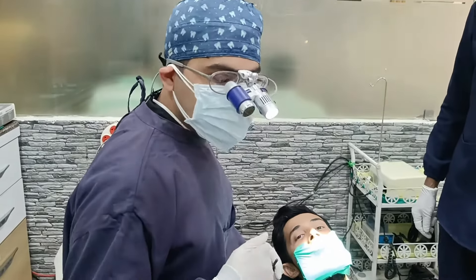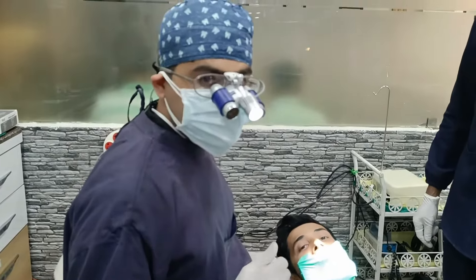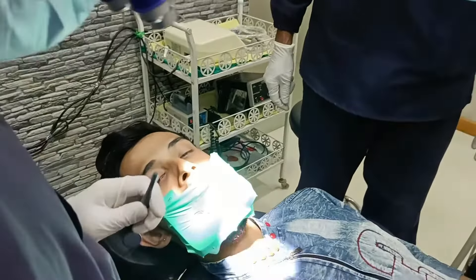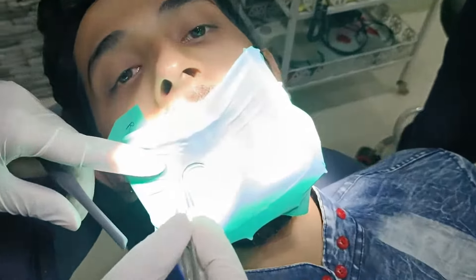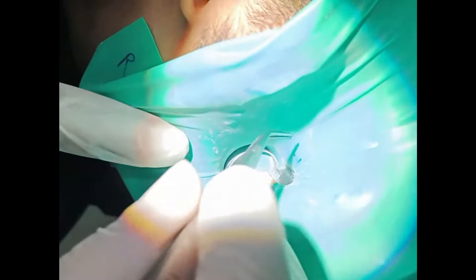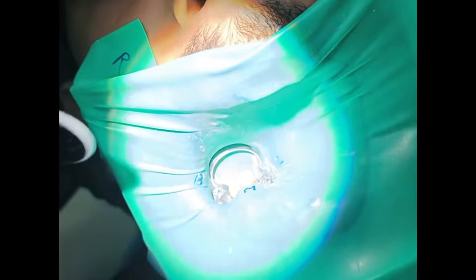Hi guys, come — I will show you some peculiar case of a root canal treatment, please come. If you can see, this is the buccal part, lingual, mesial and distal — I have already marked for your reference.